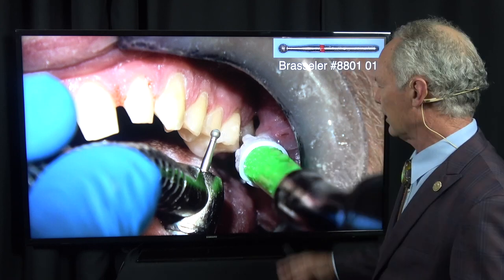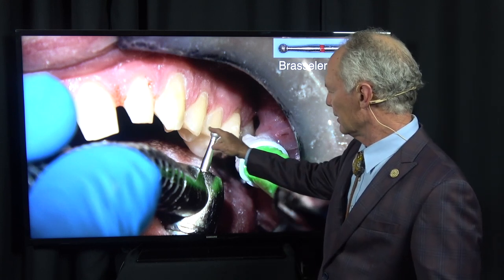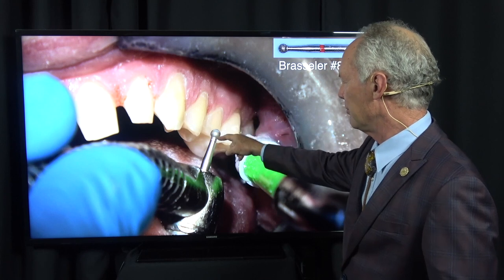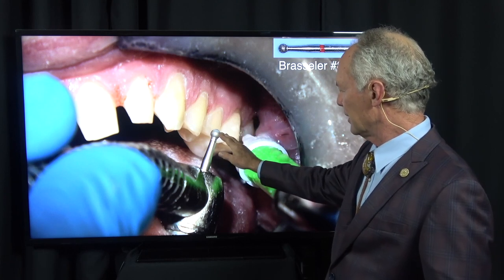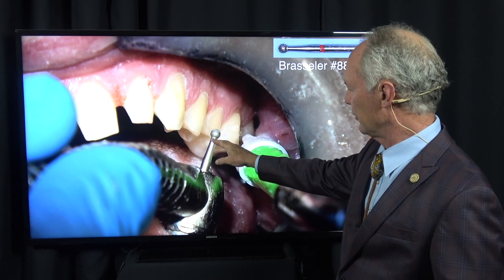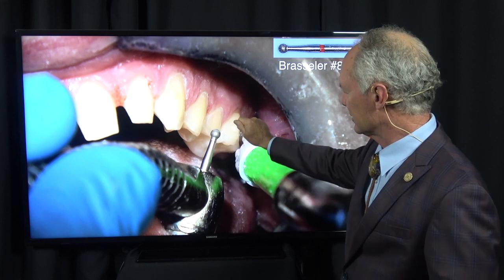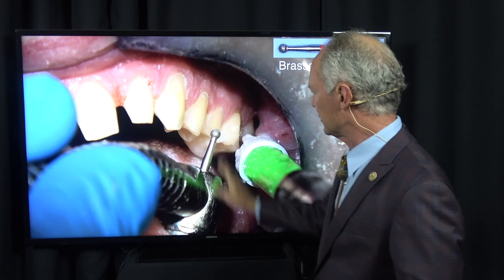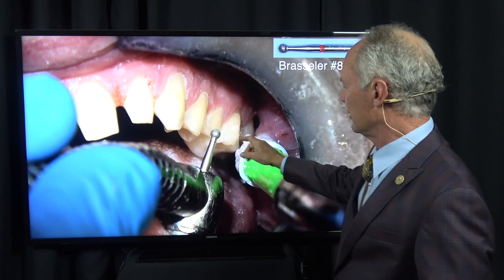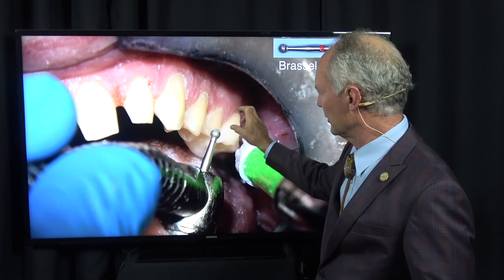Now this is a kind of a medium-sized round burr. And what I'm doing is cutting a lug into the facial incisal aspect of the bicuspid teeth. Now, this does a couple of things. Number one, it protects the occlusal surface of the provisional veneer from bruxism. Number two, it provides a seating stop. If you just prep the facial surface of that tooth, the veneer will swim or it'll move when you seat it. So you need this lug so that when you put the veneer in place, it has a stop.